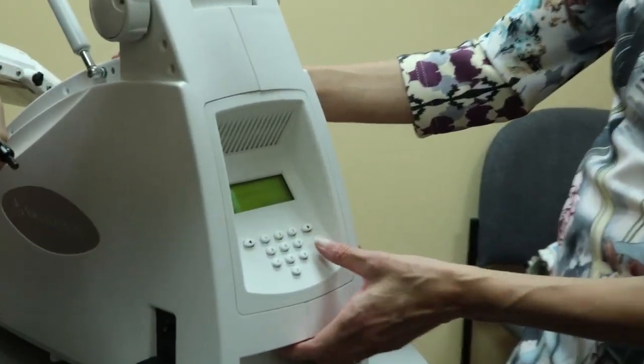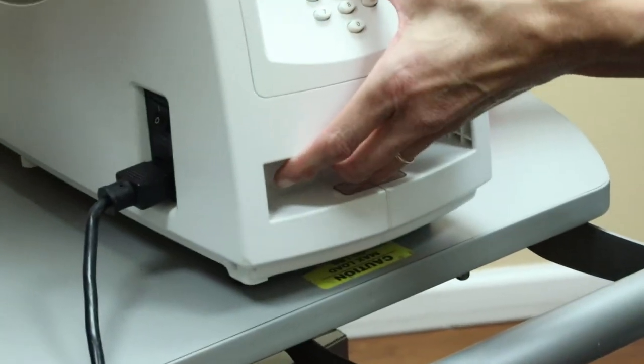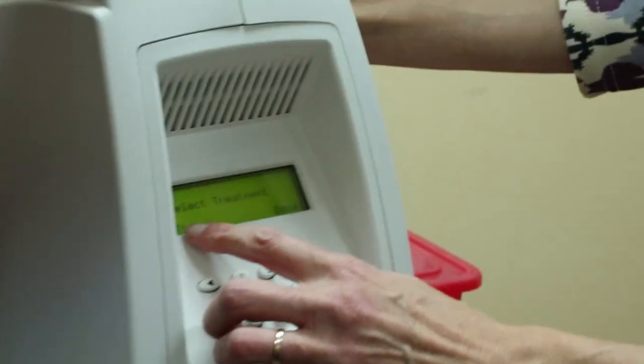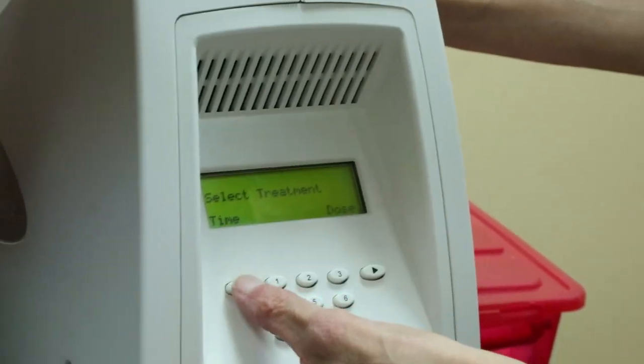So now you can go to menu. There are a number of different ways of programming the treatment. You can do it by minutes or you can do it by energy. Most of the time we do it by minutes. We're going to select, enter the pin — it's now asking us. 1-2-3-4 is the pin. You can select by time or select by dose.